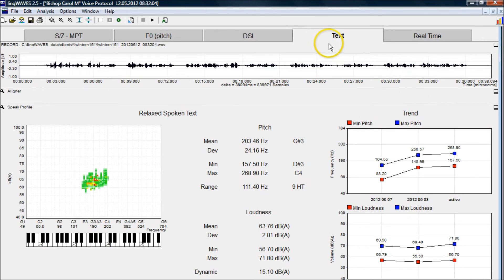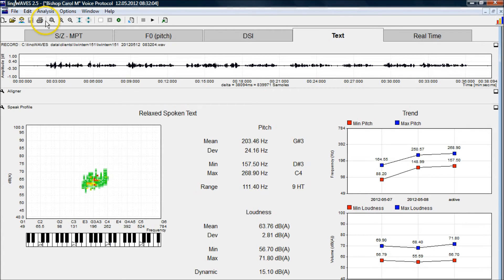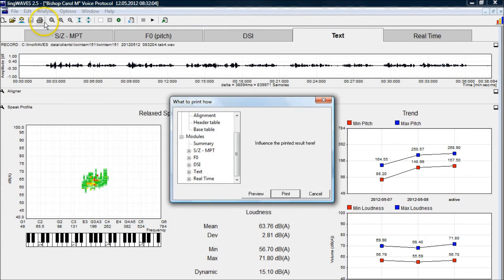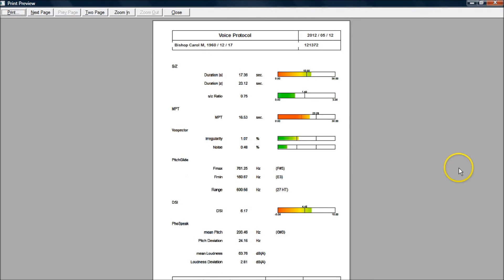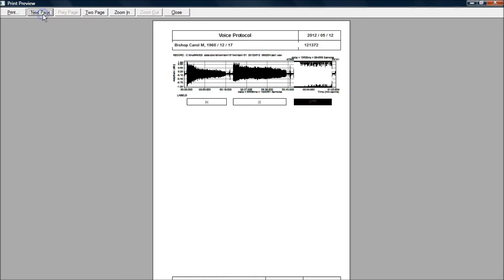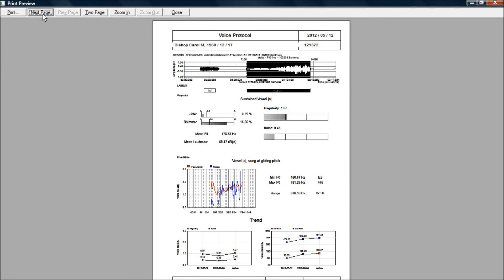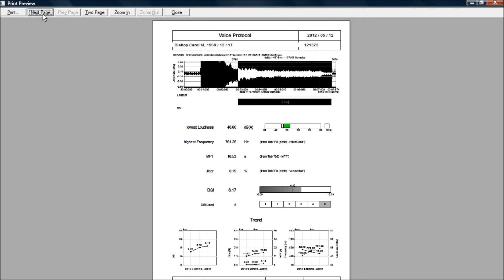And that concludes the formal part of the assessment. From here we always save our work, or it will always prompt us to save when we go to close it. We want to print a report, so we go to the print icon, and we can look at it if we go to preview. This prints a comprehensive report of the whole voice protocol assessment. You'll see all our measurements and results in here, and when we're happy with that, we print.